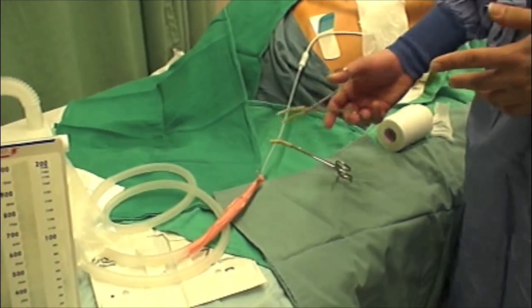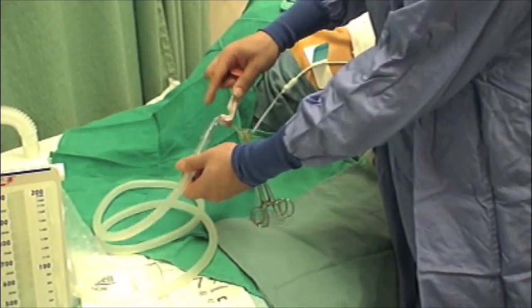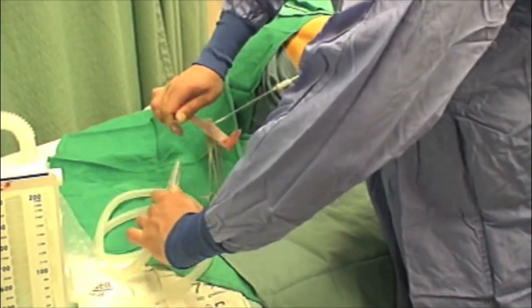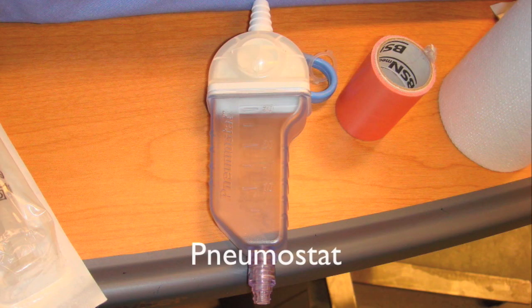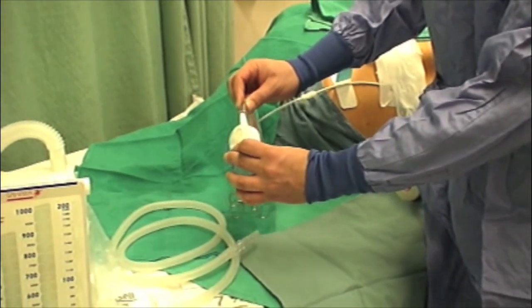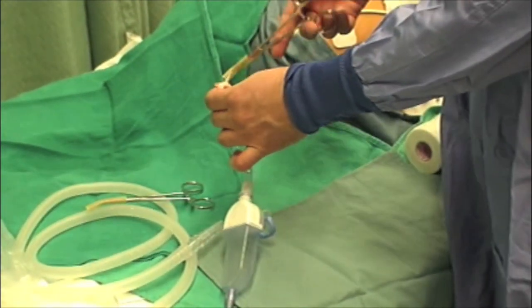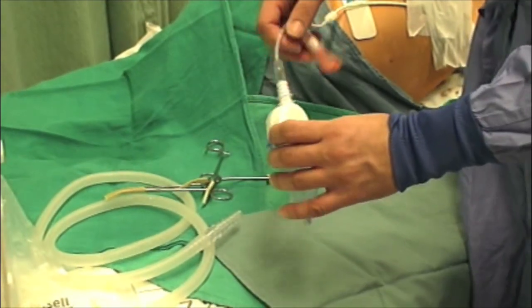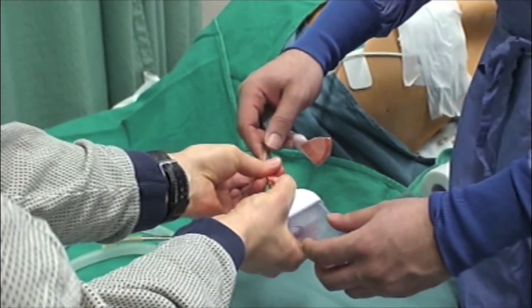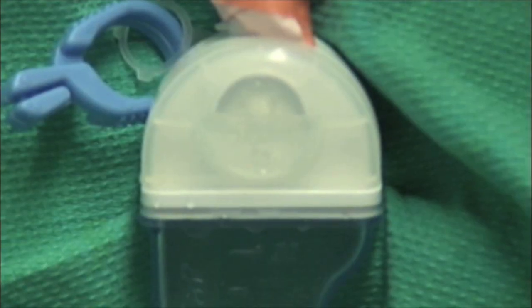If chest x-ray and patient status are satisfactory, clamp the connecting tube and remove the Plurivac. Attach the pneumostat. Remove clamps. Apply waterproof tape to the connection. Place a few drops of fluid in the bubble chamber of the pneumostat. Ask the patient to cough and observe for air bubbles.